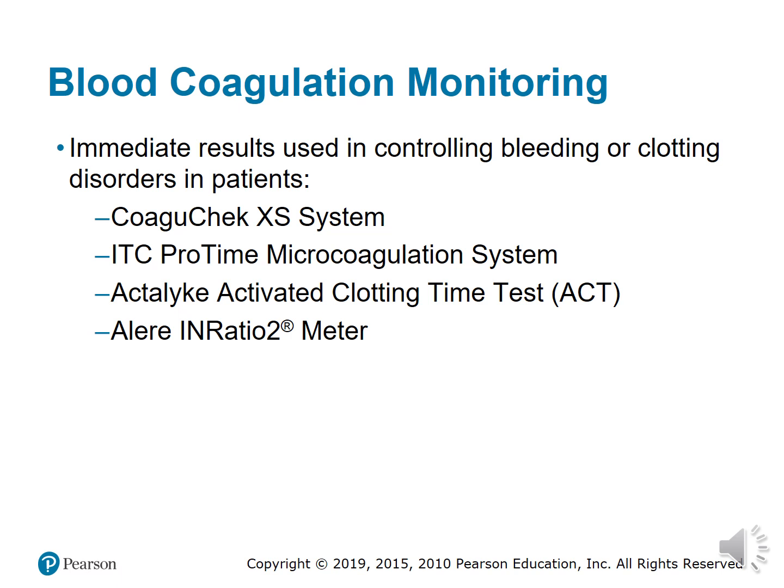You have the CoaguChek XS system, the ITC ProTime microcoagulation system, the ACT, or Activated Clotting Time test, and the Alere INRatio 2 meter.